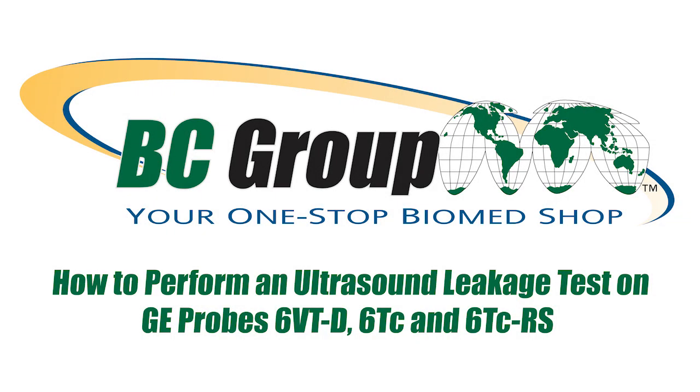How to Perform an Ultrasound Leakage Test on GE Probes 6VTD, 6TC, and 6TCRS.